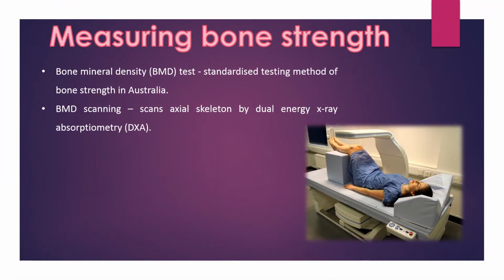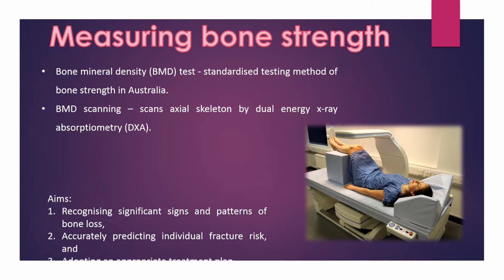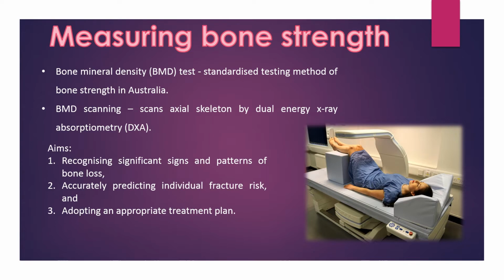A bone mineral density test is the standardized testing method of bone strength in Australia. Bone mineral density is acquired by scanning the axial skeleton by dual energy X-ray absorptiometry, or DEXA for short. The aim of scanning for bone strength is to: 1. Recognize significant signs and patterns of bone loss, 2. Accurately predict individual fracture risk, and 3. Adopt an appropriate treatment plan.